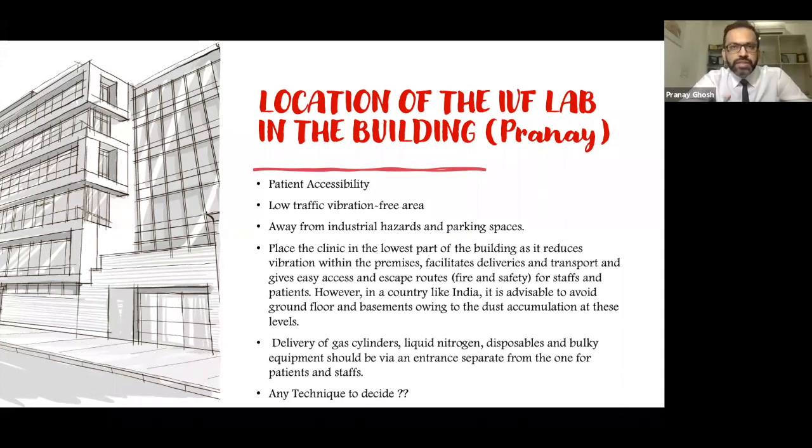And once you've decided on the building, it is a good idea to locate your lab in the lower parts of the building, because the lower parts are less prone to vibration during your micromanipulations, and they facilitate the delivery and transport of liquid nitrogen and bulkier equipment.